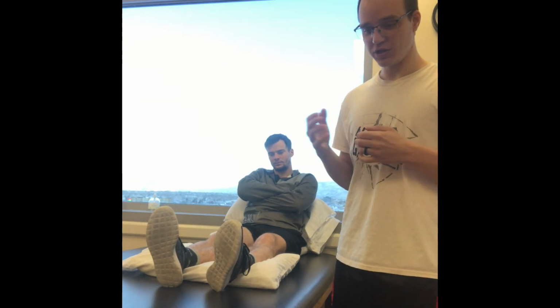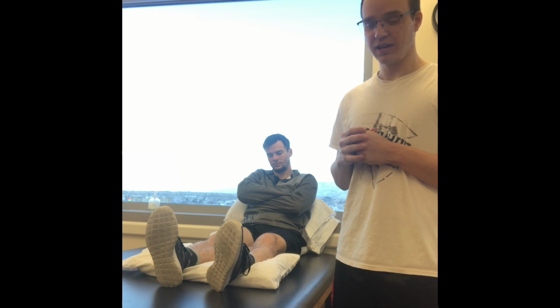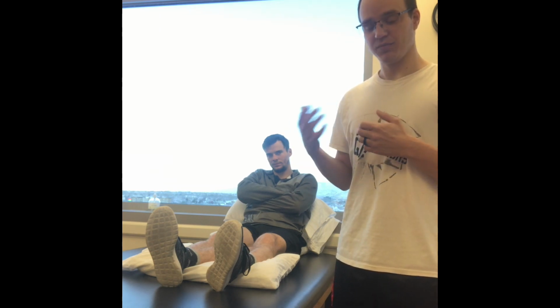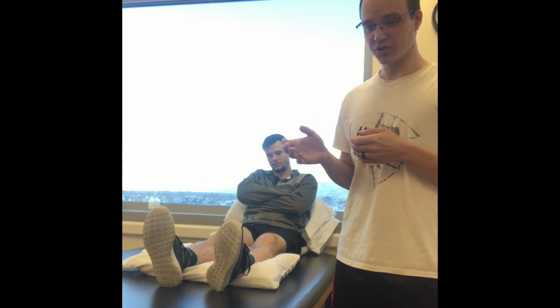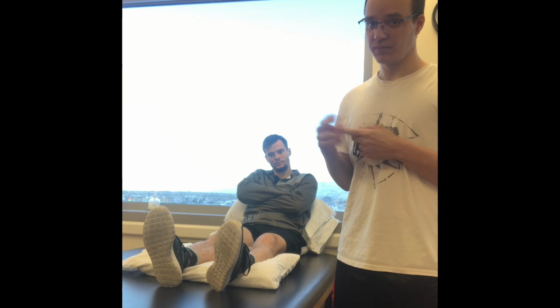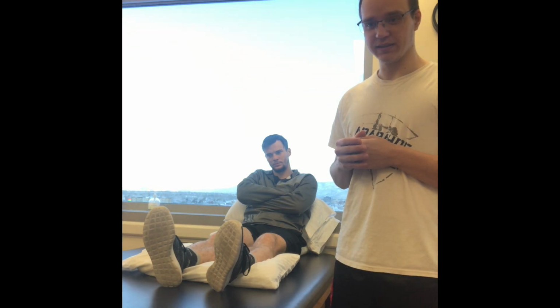Another is if the patient is pregnant and has a history of miscarriages, you would want physician approval before you use this at all. And if the patient is pregnant but doesn't have a history of miscarriages, you would obviously not want to go around the abdomen or the pelvis. Another contraindication is if they have any type of seizure disorder like epilepsy. Again, avoid doing this on a patient. And finally, you wouldn't want to do this over reproductive organs for obvious reasons.